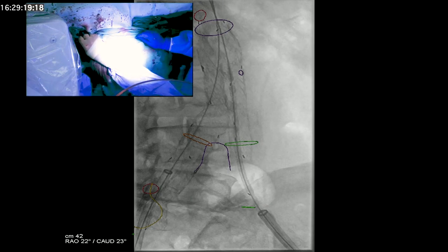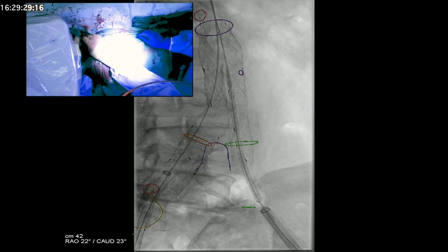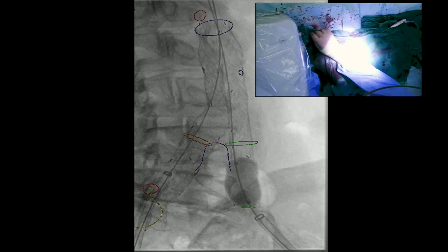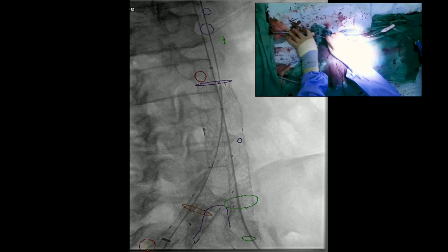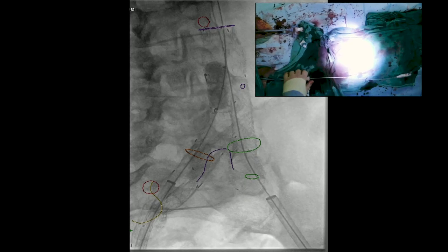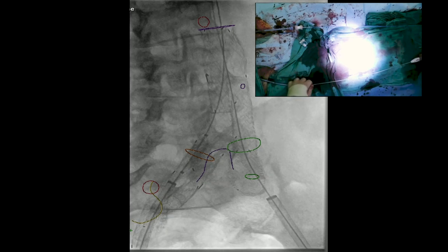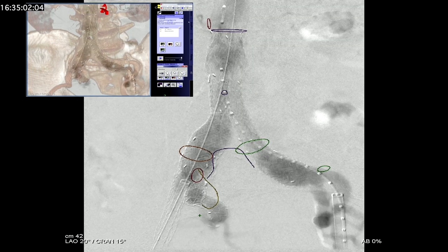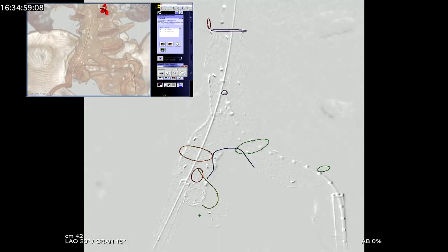We measured the distance to the bifurcation and the bell bottom has now been brought up into position — that's the reason we need an 18-French sheath on the left side. The green circle is the origin of the internal iliac artery. The device has been deployed and we use our aortic balloon to dilate it into place serially, then do the same on the left side. The pigtail marker is placed and we perform a completion angiogram. The completion angiogram shows the aorta is filling with no evidence of an endoleak. Thank you very much for your attention.